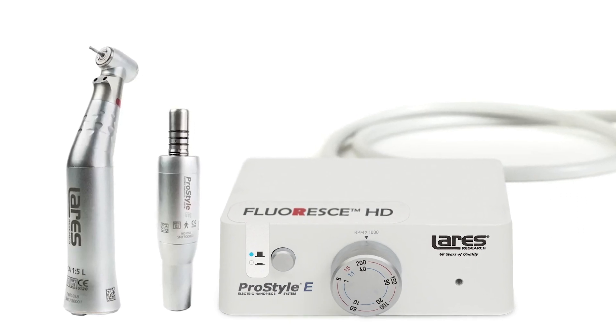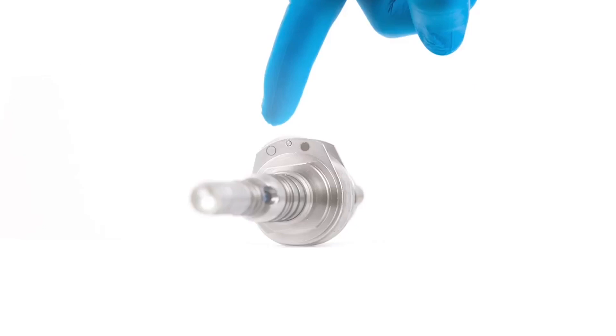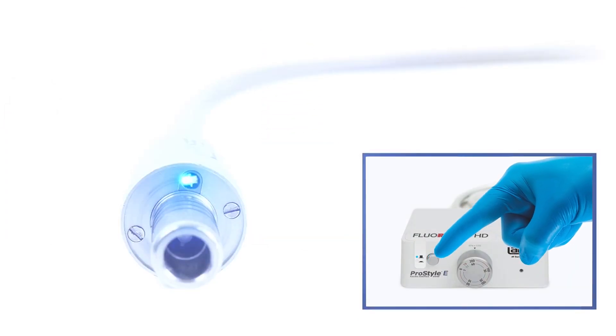Floress HD lets you switch your air turbine or electric handpiece from bright white light to UV light at the press of a button. During caries or composite removals, the high-intensity UV light transforms the mouth into a precise, colour-coded map.